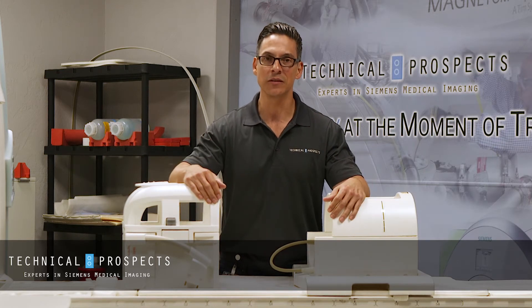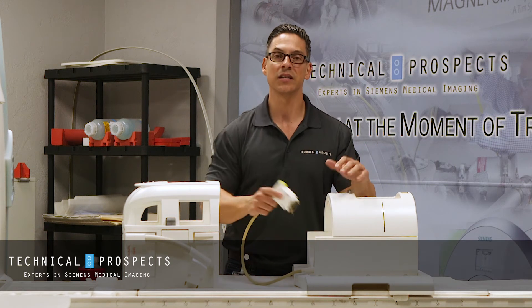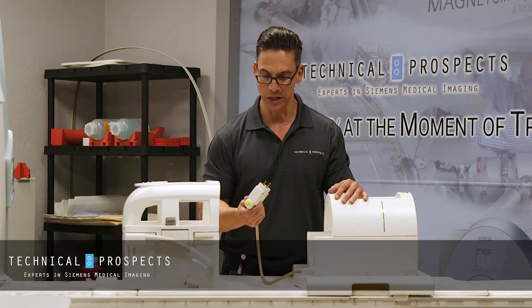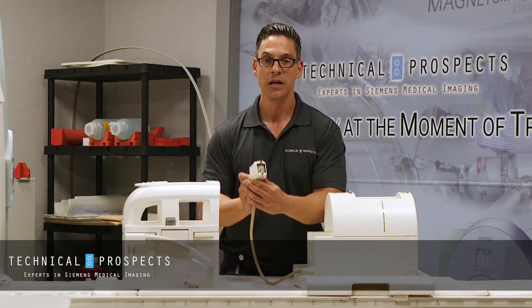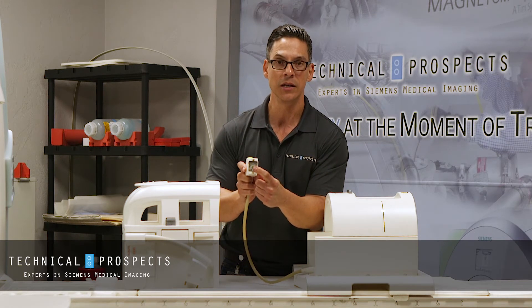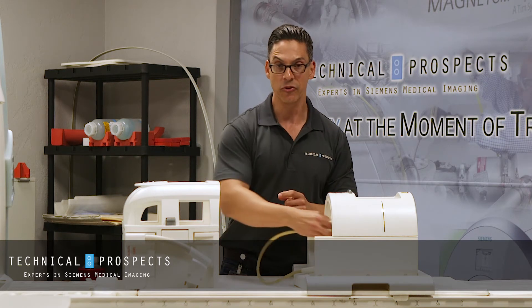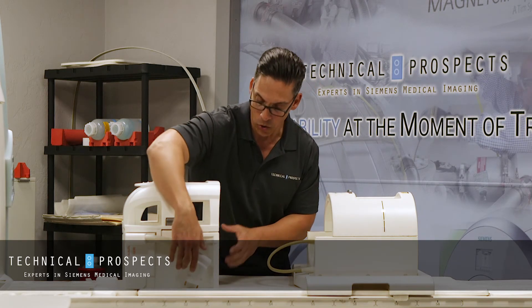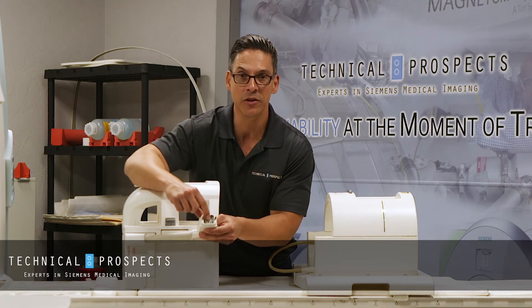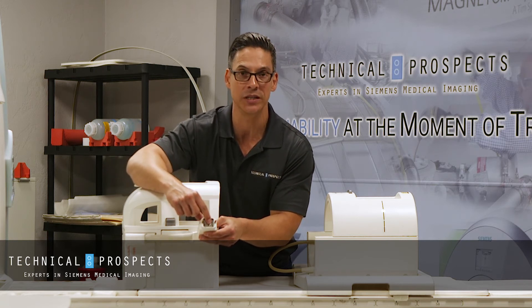A really simple test — it's all in the plug. This is a knee coil and it is a transmit receive coil. You can test it quickly by just looking at the plug. The transmit receive coil will have a copper plug in the middle, whereas a receive only coil does not have a copper plug — it's basically just a fill-in plastic piece.